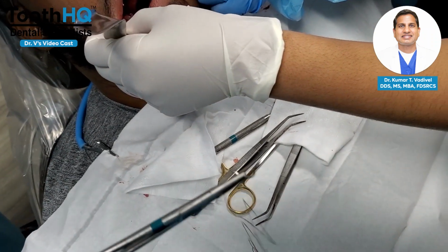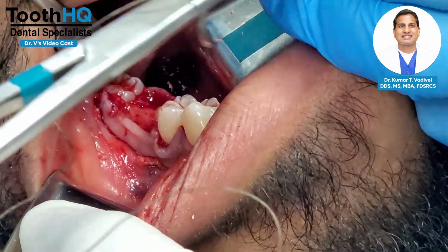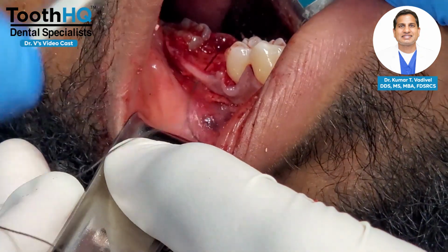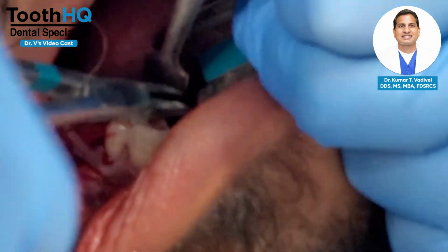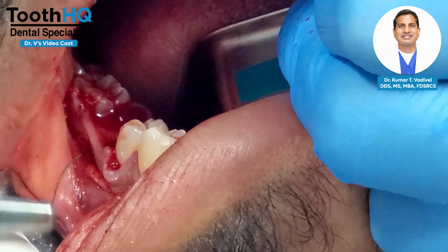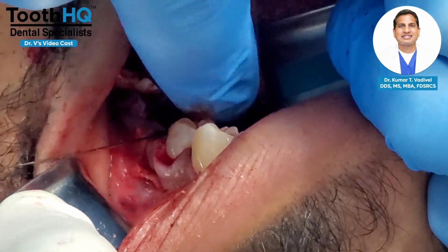So I took my 3-0 chromic out here. I'm going to go from the buccal. I'm going to go out from the buccal, I'm going to come out, and now I'm going to go to the lingual. I'm going to come out of the lingual. Okay, now I come out, and it is an interrupted suture here, because I went one tooth on the front as well as on the back. I got a lot of room I can just use to get a primary closure.